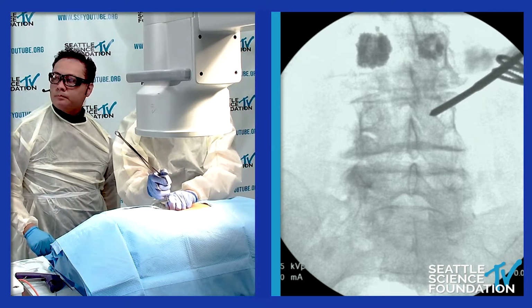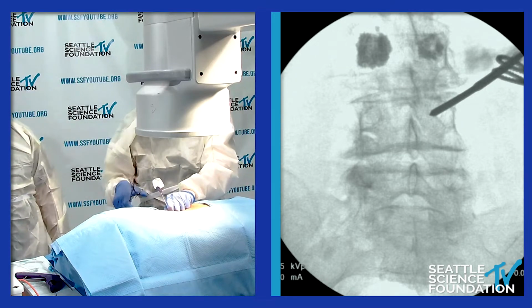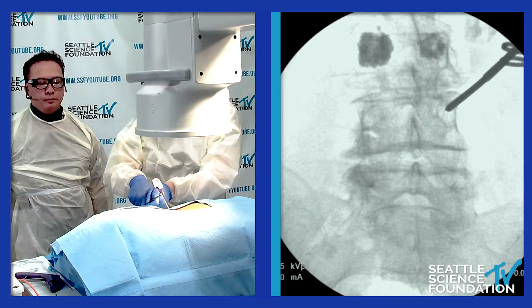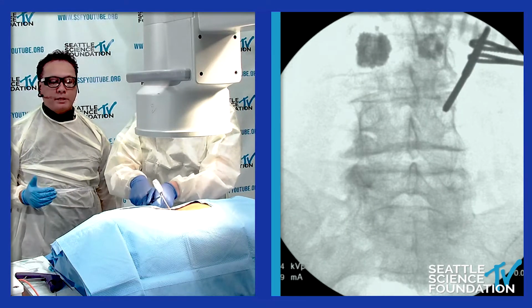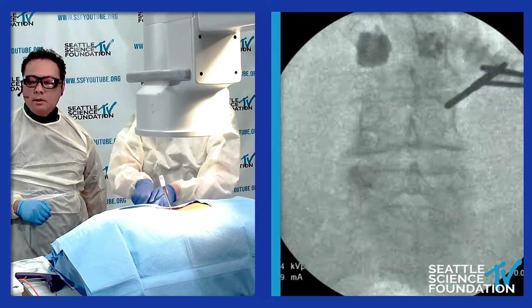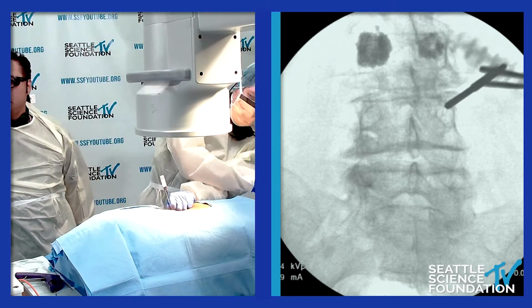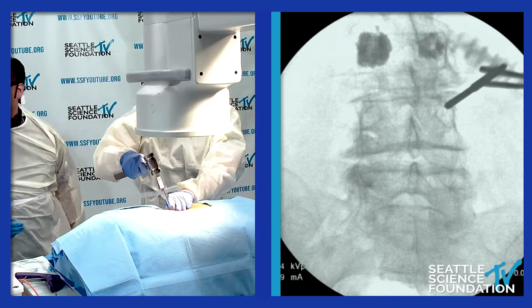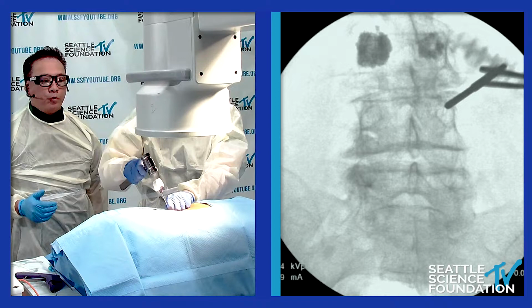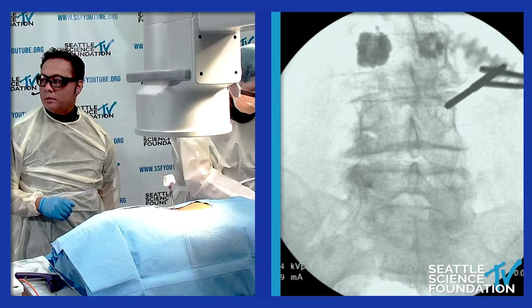So Glen, are you doing a vertebroplasty or a kyphoplasty? We're going to be doing a balloon kyphoplasty in this scenario. I know a lot of times people ask, what is vertebroplasty? What is kyphoplasty? Vertebroplasty is simply accessing the vertebral body with a trocar, removing the stylet, and then injecting the cement. With that, you have an increased risk of extravasation occurring, quite a high rate, anywhere from 40% to 75% with vertebroplasty, with some of the papers quoting.